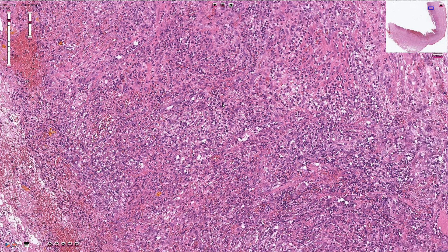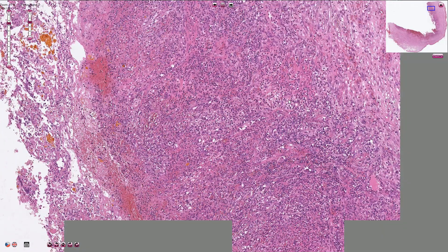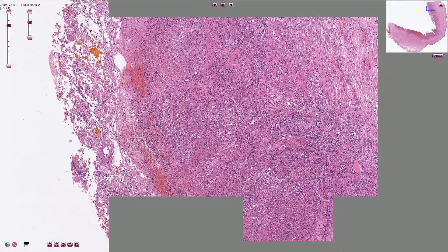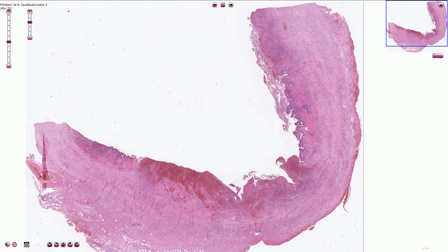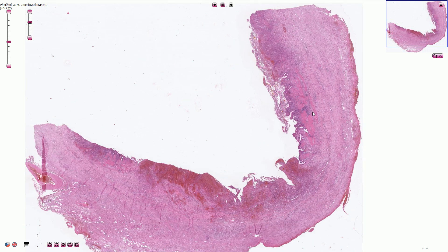Over time, the inflammation can infiltrate the whole wall of the gallbladder and spread to the adjacent tissues — that would be called phlegmonous cholecystitis. Sometimes we can find partial necrosis of the wall of the gallbladder, which is not the case here, and we would call it gangrenous cholecystitis.